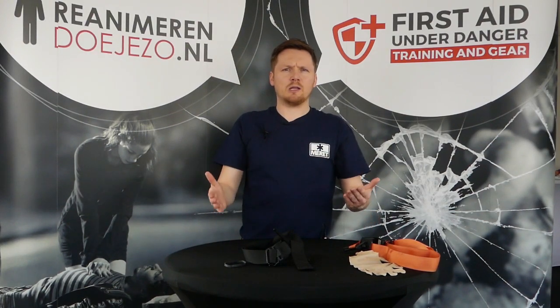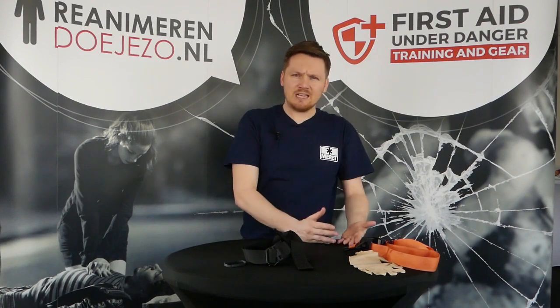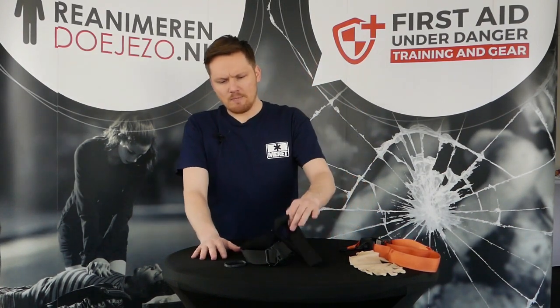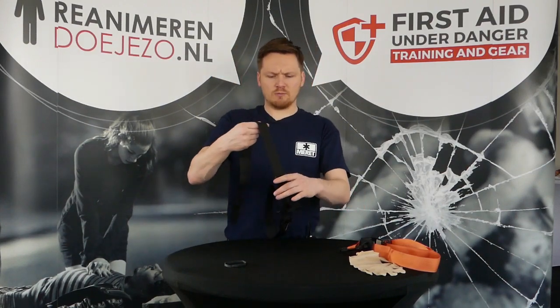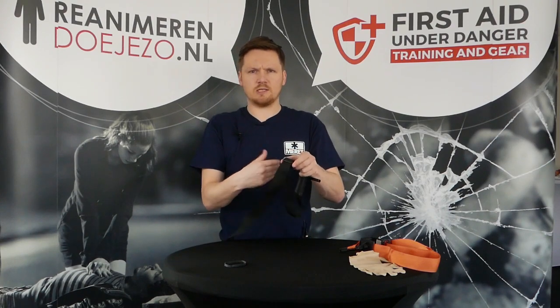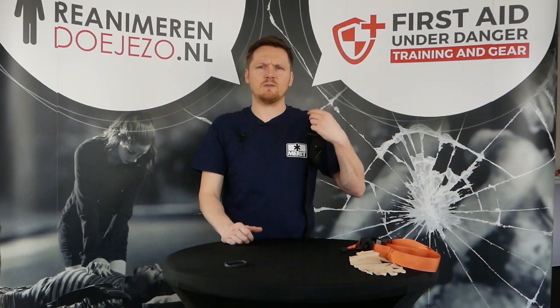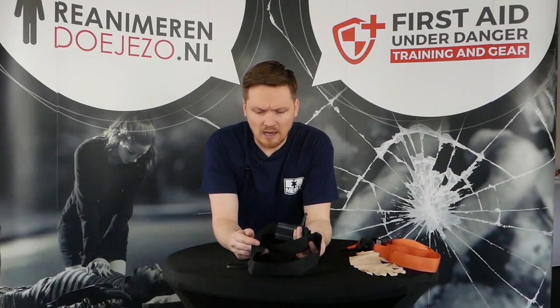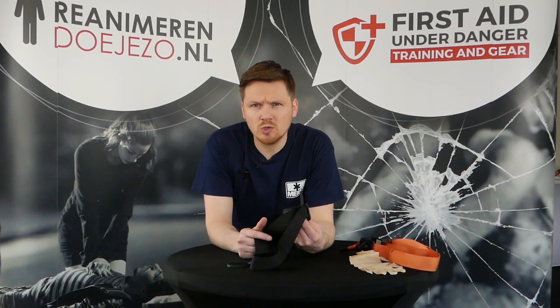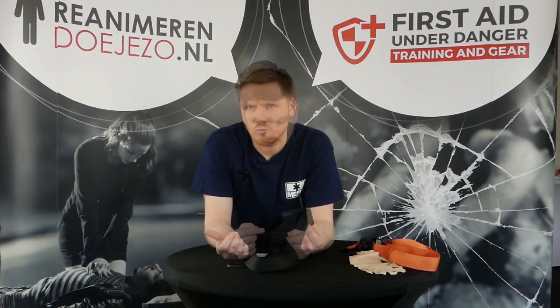You can just unbuckle it, buckle it up again, and that is much quicker. So that's also a plus for the soft tourniquet. There's no Velcro on it, so it's much easier to maintain. And you can just dust it off if you have it, for example, on your ops vest. And if it does get really sticky and muddy, it won't come loose because there is no Velcro.